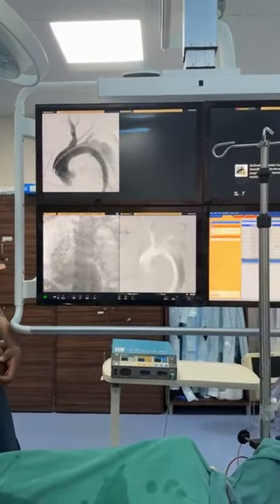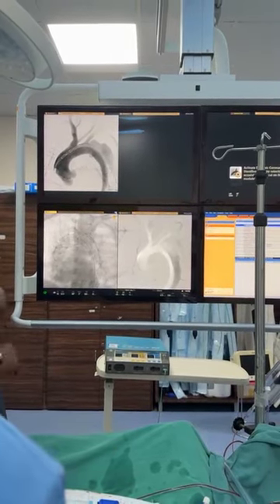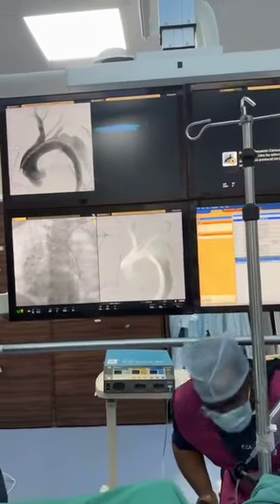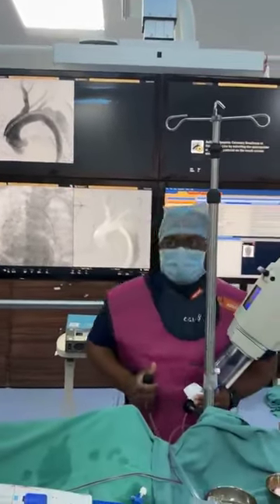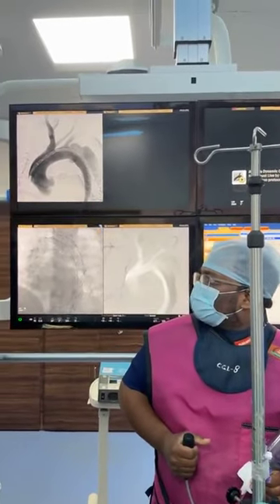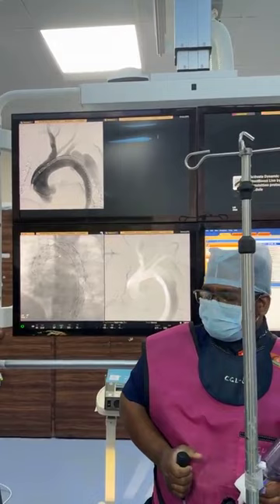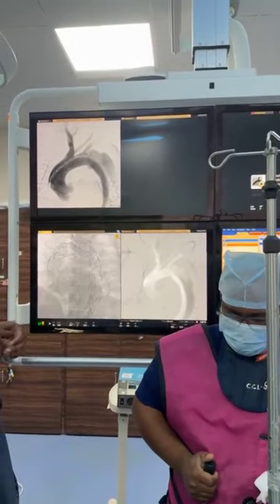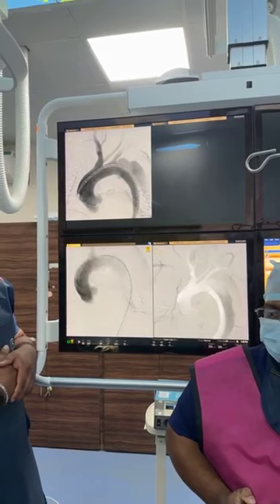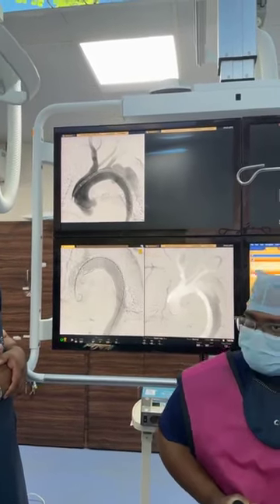Okay, are you ready for one more injection? No, this is good. Are you ready for the injection? Dr. Prashant? Table free chair. I will request for apnea, please. Apnea? Inject. Oh, perfect. Thank God. Thank you.